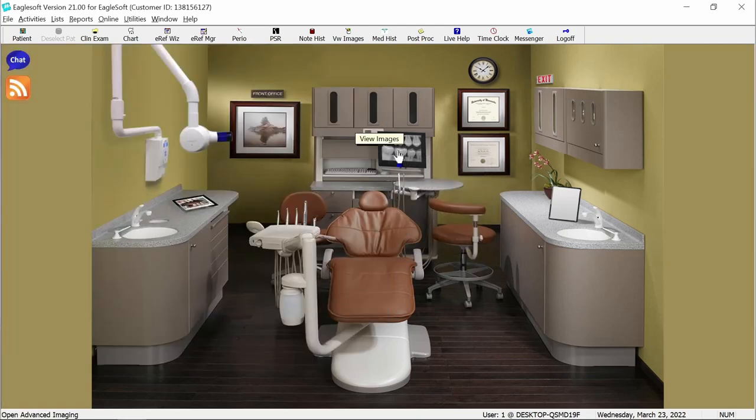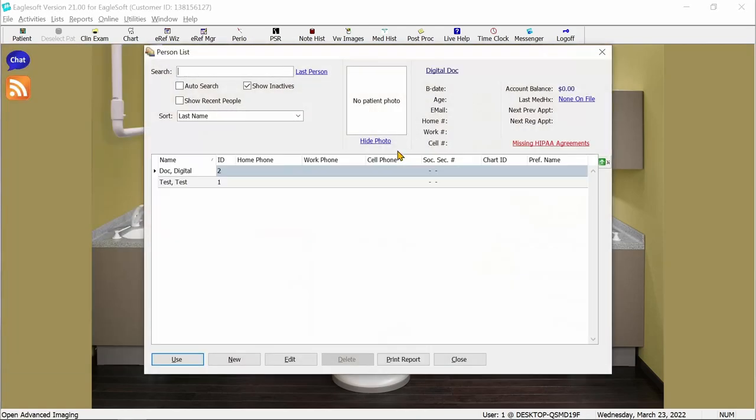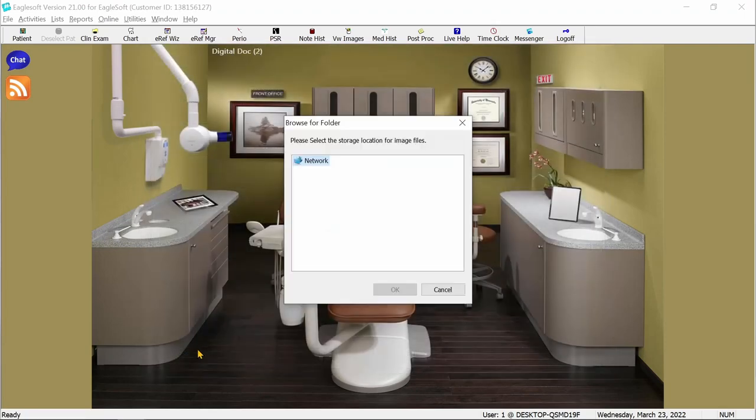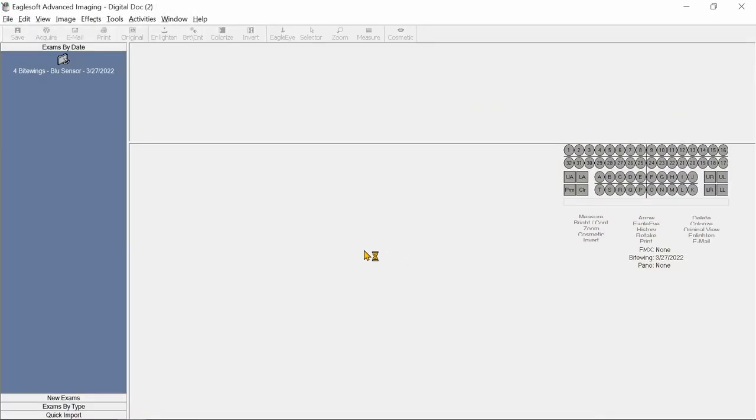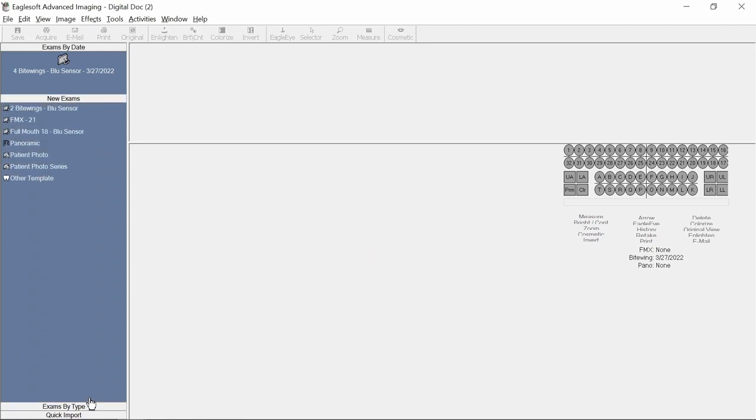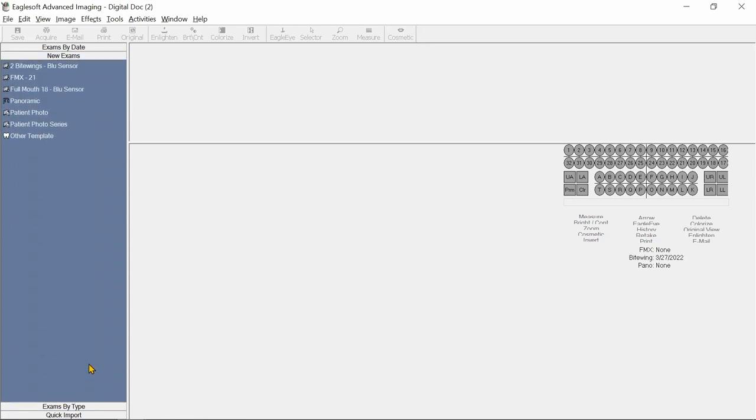Now, let's set up a new ByteWing template. We'll select a patient first, and on the left side, go to New Exams and select Other Template.